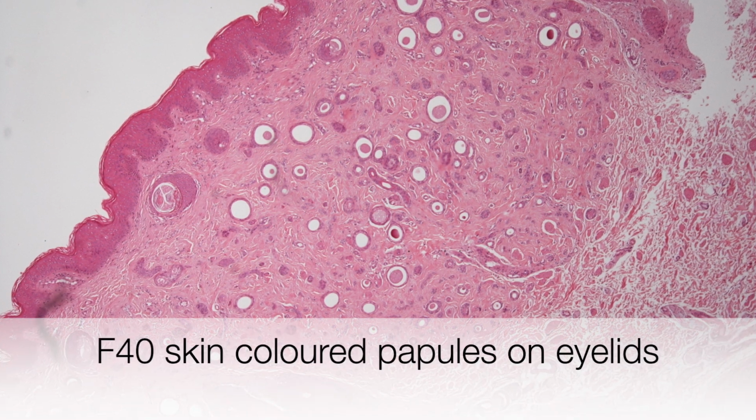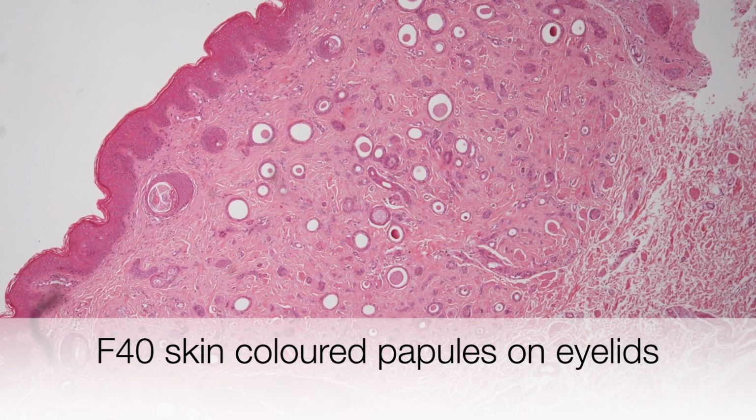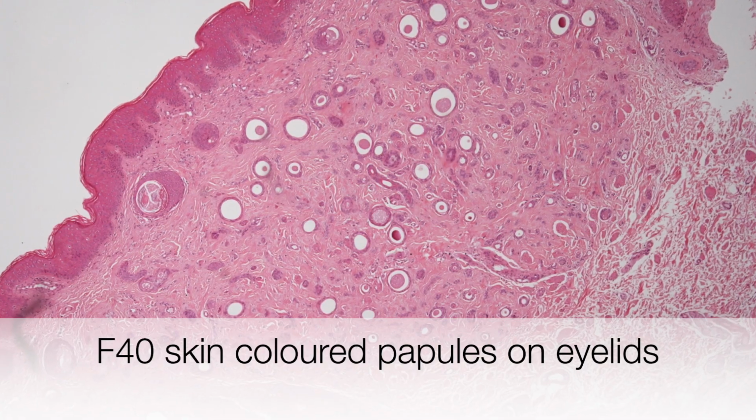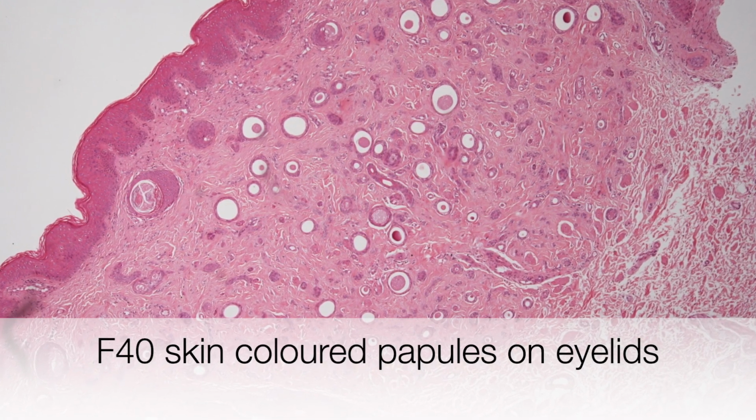Case number 3 is a female of 40 with skin-coloured papules on the eyelids. What are they?